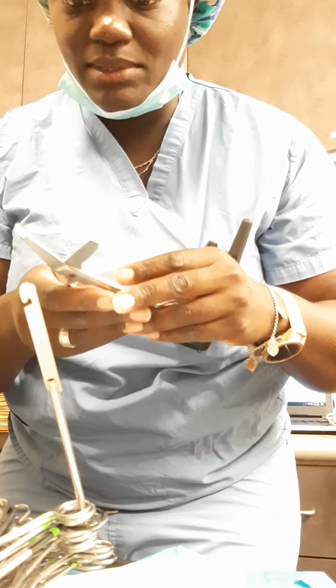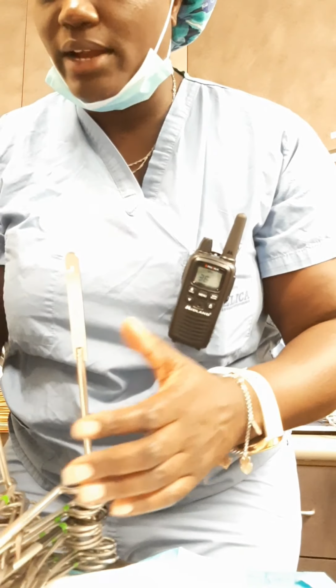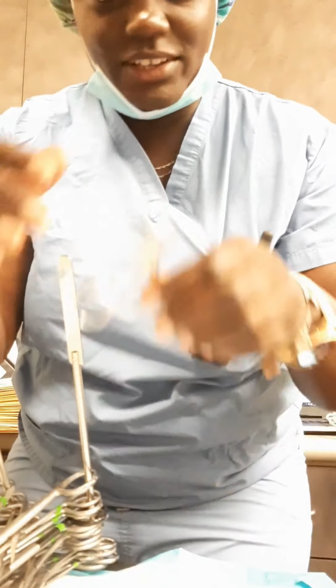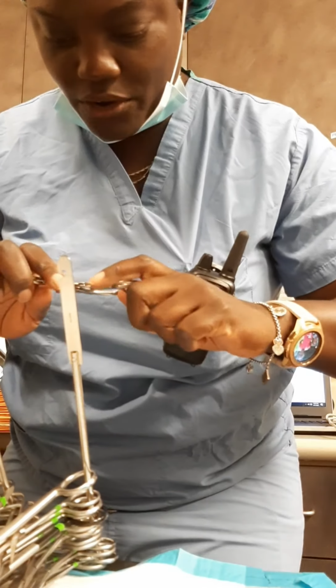And again, I'm going by fast because I already know this set, and I already know that I washed this set already, so I know that they're clean, but you still have to check. Nobody's perfect, not even your girl.